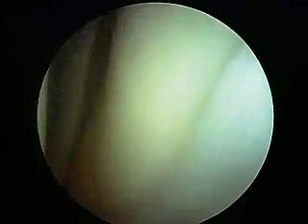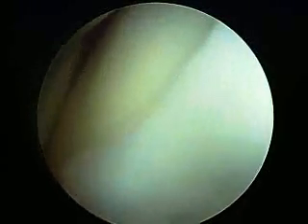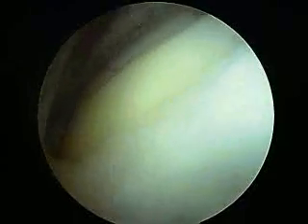This is the lateral meniscus, or outer side of your knee. This is the posterior horn of the lateral meniscus. I'm going to clean that little distal stuff up, but that's not really a tear. And I've been all over this meniscus, top and bottom, and there is no tear there.